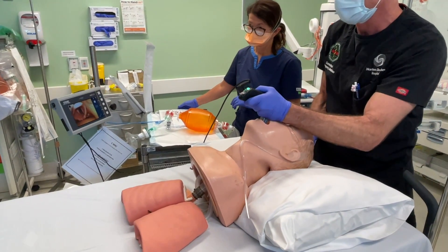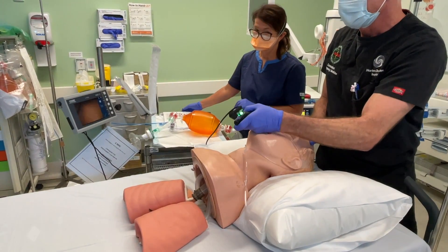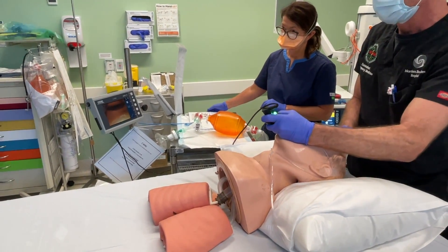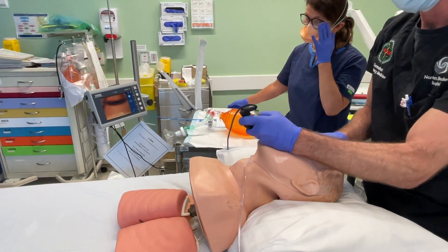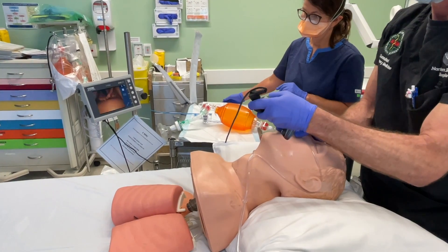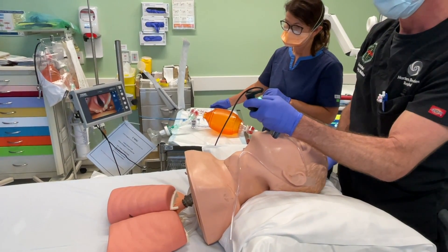If those sequences fail, my next step is to insert the blade all the way in so the tip is in the esophagus. I then lift and pull back, and as I do that, it exposes the cords. Going in to the esophagus — that's the esophageal inlet on the screen there. I'm lifting the laryngoscope and pulling back, and as I withdraw, you'll see the cords flop into view. This time I've hooked up the epiglottis, it's controlled by the blade, and I've got a beautiful view there.